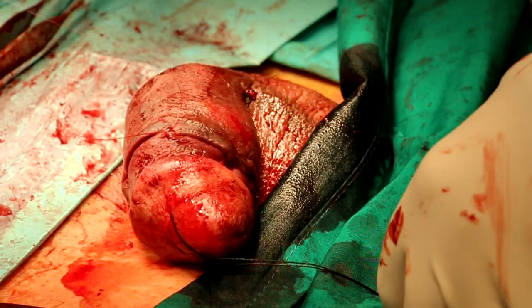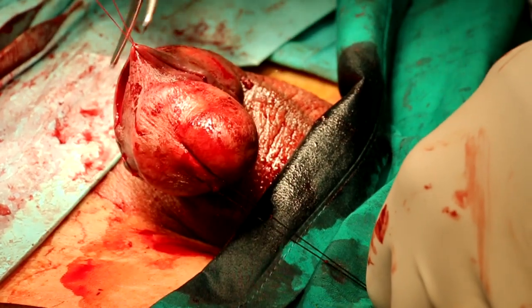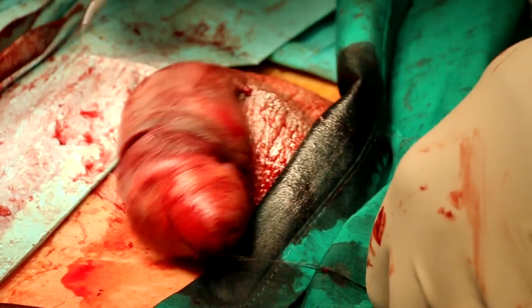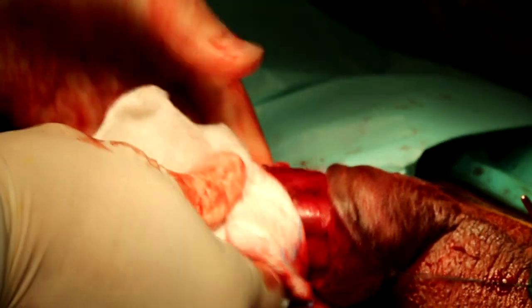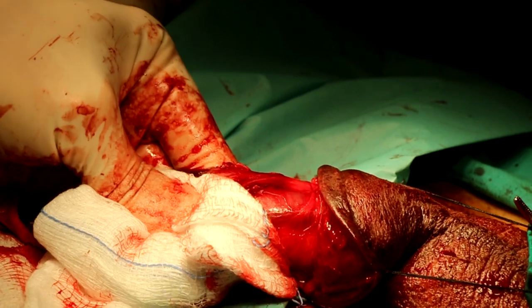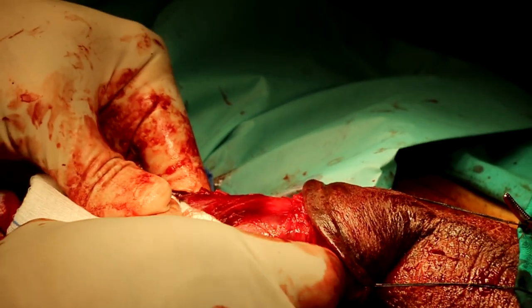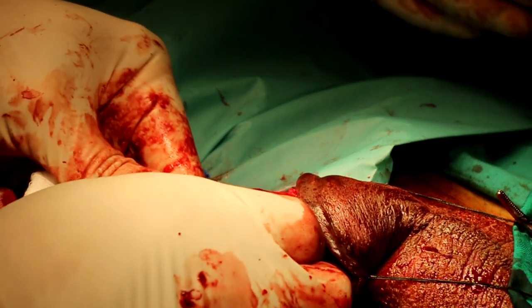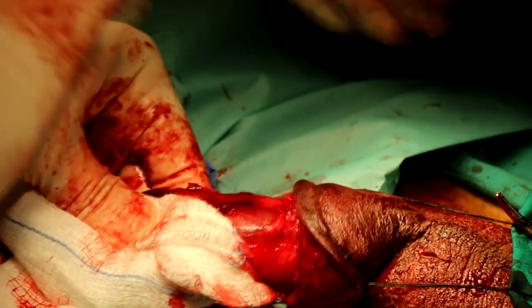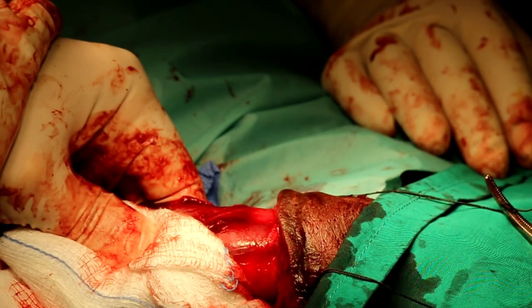As you see now, the skin is almost done and well approximated, and this should give a good cosmetic result. I want to stress two points. You may expect troublesome bleeding after release of the tourniquet. After you are done with the repair of the tear, don't take any more sutures. Just compress, and compress, and compress. Three to five minutes of compression is the only solution in such cases.